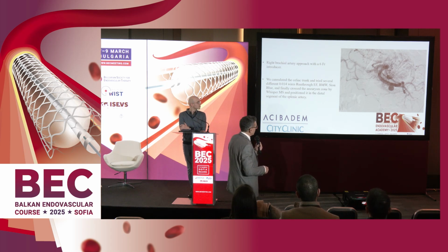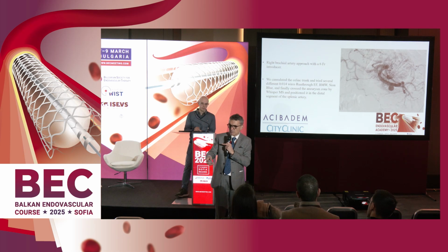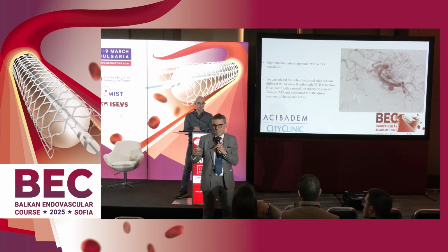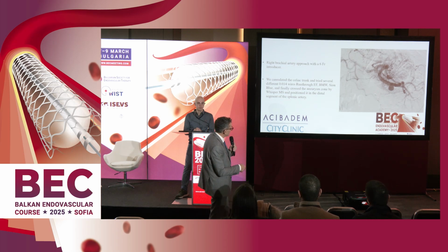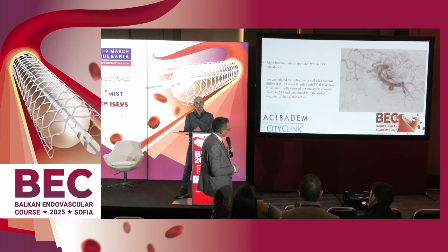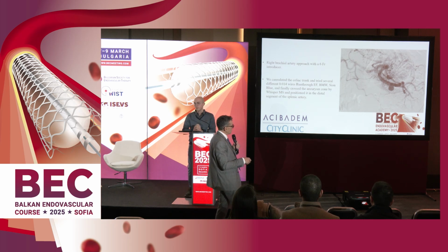So in case we have a pathology on the visceral and renal level, in tall guys, the radial artery is not possible because there is a distance from the radial artery to the visceral vessels. And in tall guys, there are no guiding catheters of 120 centimeters. The main part of the catheters are 100 centimeters. In order to shorten the distance to the tip of the catheter, we are shortening the access point. So instead of going radial, we are going brachial. Only in such a situation, the extremely tortuous celiac trunk can allow us to go deep by the wire, by the balloon, and by the stent.